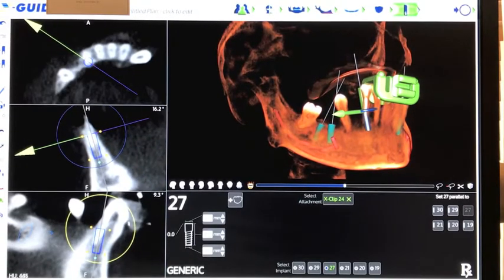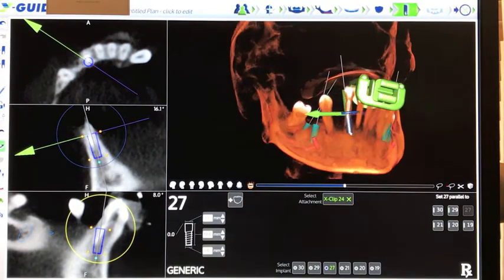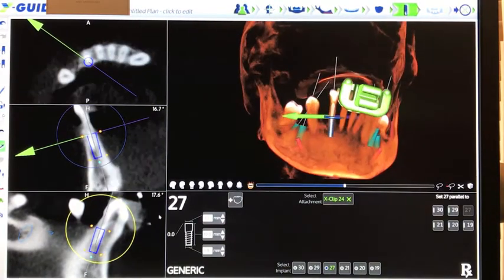You will notice in this case that positioning is very important due to the proximity to the nerve.